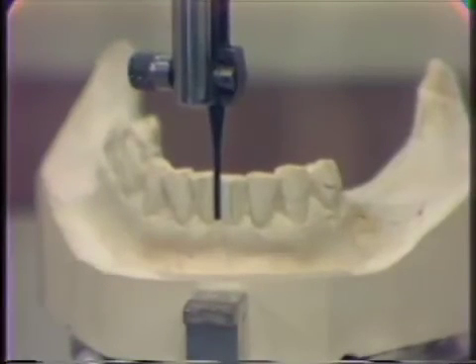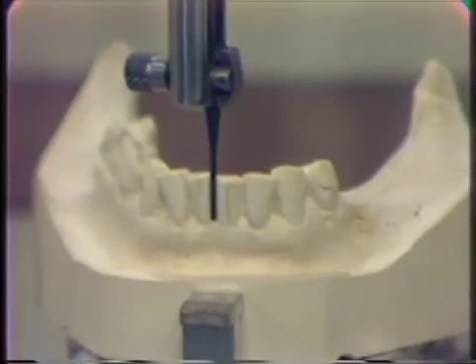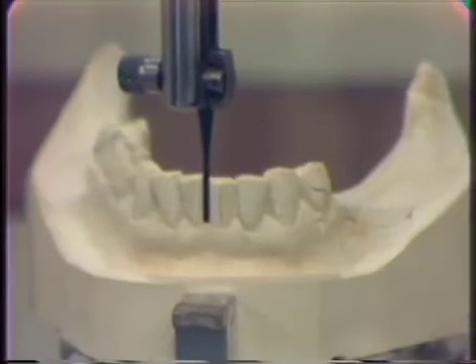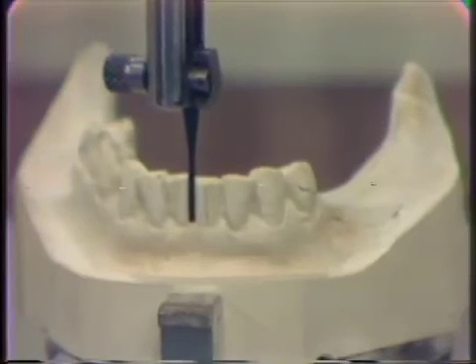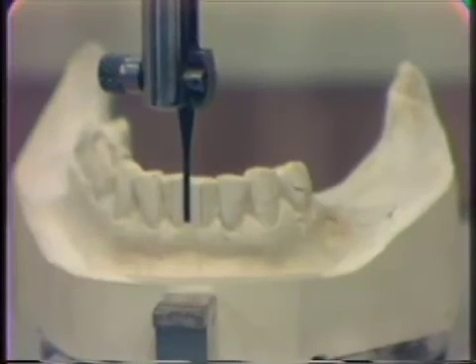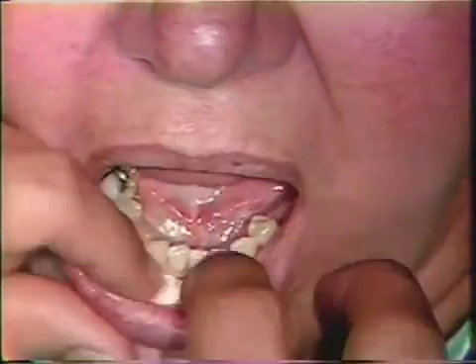To accomplish this, we look first at our proposed path of insertion on the surveyor. With that proposed path of insertion as a guide when we grind in the mouth, we shall put a pencil line — scribe the pencil line there — parallel to the path of insertion as a visual aid. We will also place this line in the mouth, use it as a guide, and using a parallel-shaped stone, we will try to go parallel to that line and disk the lingual surface of the bicuspid. In the mouth, we'll first scribe that anterior line.